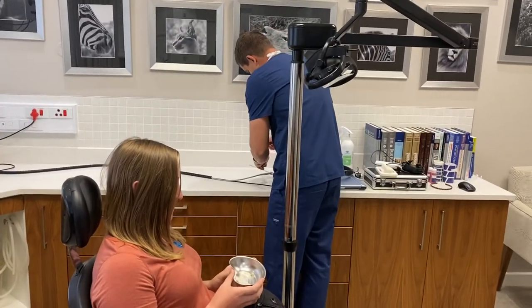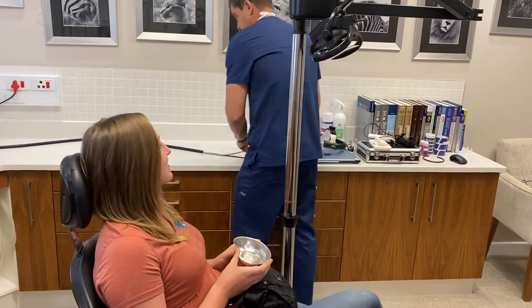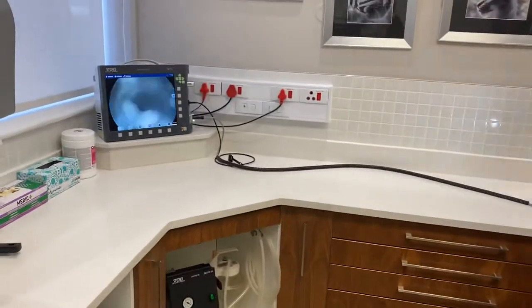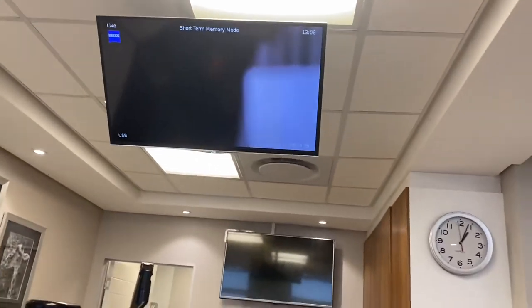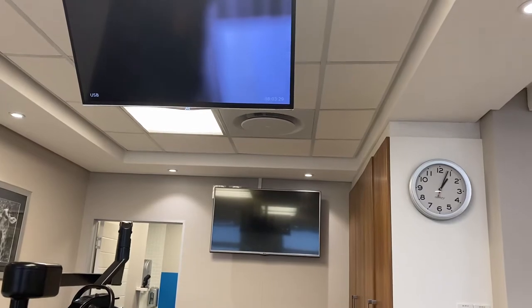Okay, you can film up onto the screen now. We're going to put on this light and have a look. Let's see the mass of septal perforations — let's just see how things appear inside. I'll put that screen on for you.